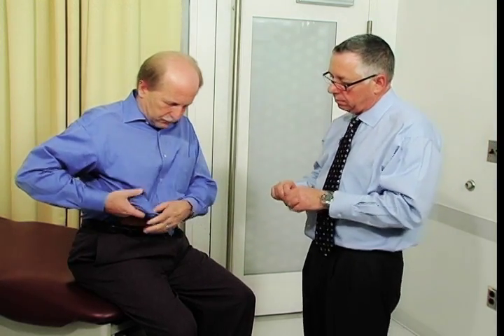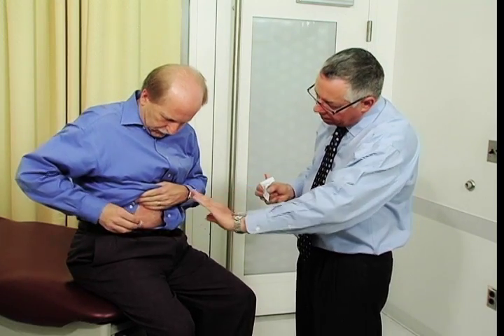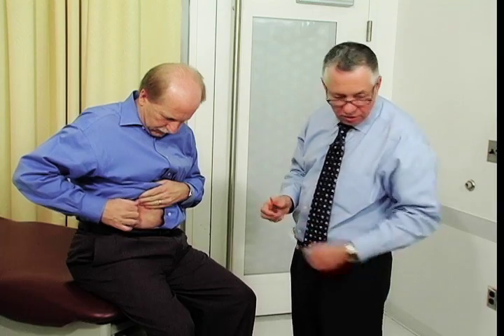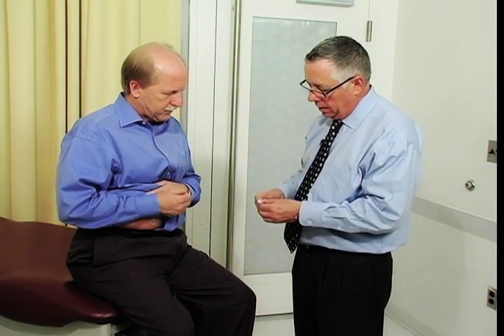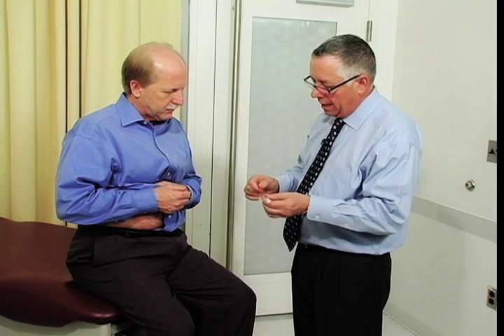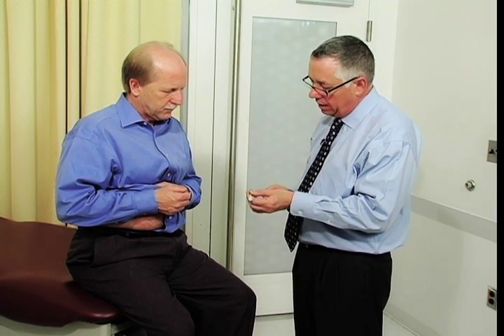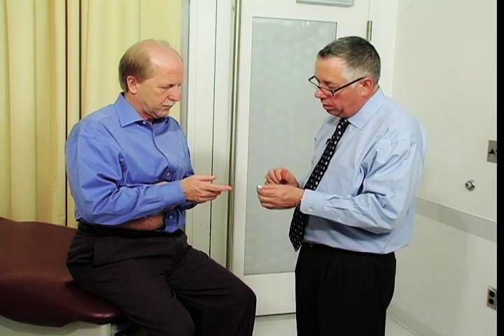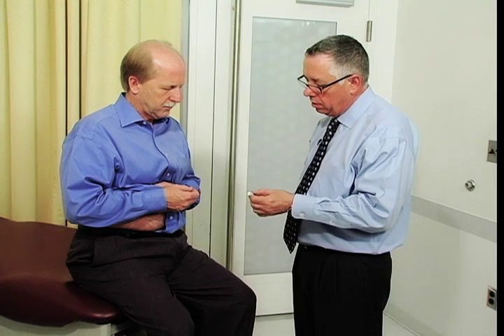So let's start with lifting your shirt up. Gently, I'm going to take an alcohol swab and, a couple of inches to the side of your belly button, just gently swab the area. Then I'm going to take the cap off the syringe. Now you have an exposed needle, so you want to hold it with your index finger on the barrel, between your second finger and thumb.